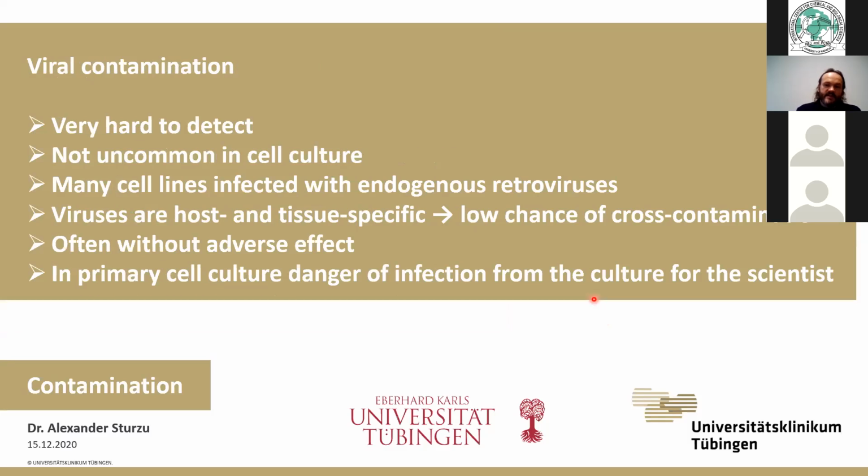Now, the final contamination is viral contamination. This is not playing a big role in the discussion of contamination. First, because it is very hard to detect. And second, because, as I mentioned here, often it is without any adverse effect for the cells. But studies have found that it is not very uncommon in cell culture, and many of the cell lines are already infected with viruses. However, there's very low chance of cross-contamination because these viruses are host and tissue specific.